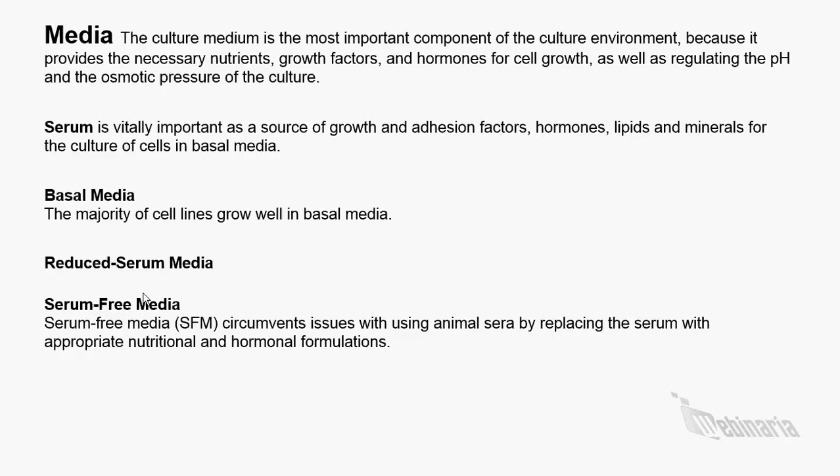There are three basic classes of media: basal media, reduced serum media, and serum-free media. Basically, they differ in their requirements for supplementation with serum. Serum is everywhere because it's vitally important as a source of growth and adhesion factors, hormones, lipids, and minerals for the culture of cells in basal media. In addition, serum also regulates cell membrane permeability and serves as a carrier for lipids, enzymes, micronutrients, and trace elements into the cell. The exact function of serum is not known.